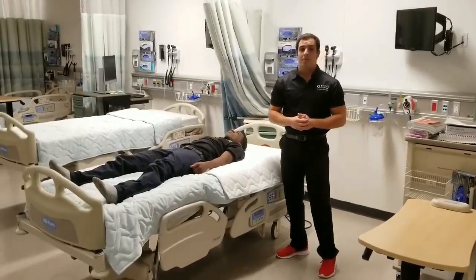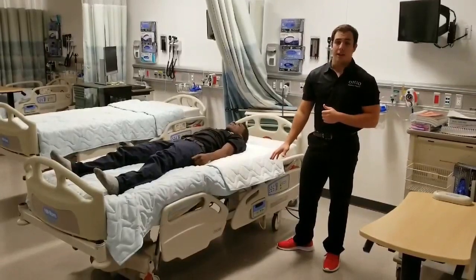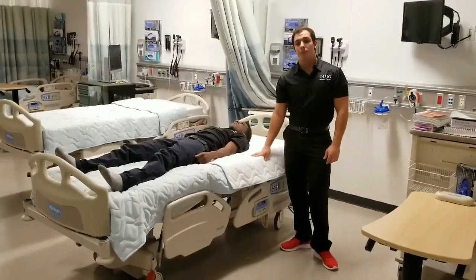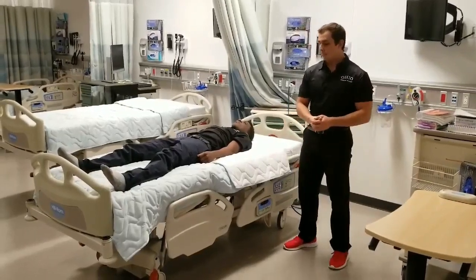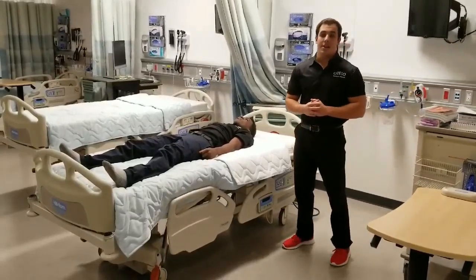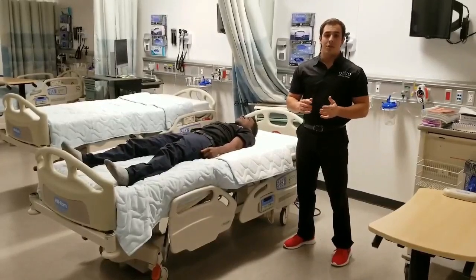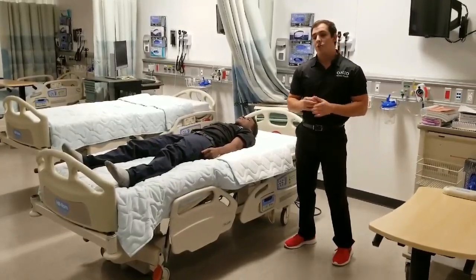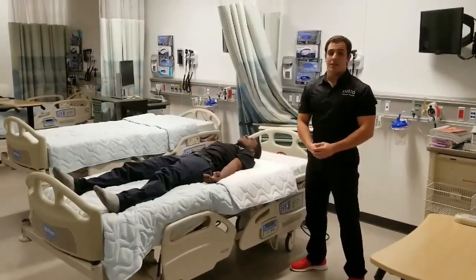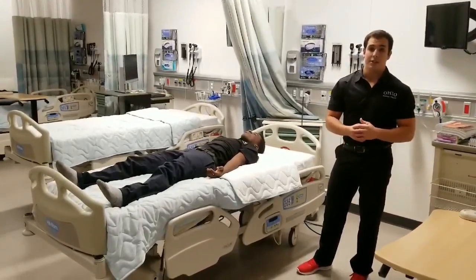Some things to consider before doing this transfer: you want to make sure that the wheels of the hospital bed are locked in place, and that the hospital bed is at a proper height for you so that you can maintain proper body mechanics throughout this transfer. Also, make sure that there's no tubes or wires in this area that will obstruct this transfer. And also, it's very important to introduce yourself to the patient and to instruct them on how and when the transfer will be made. So to begin this transfer, you want to first introduce yourself to the patient and instruct them, and then to gain their consent.